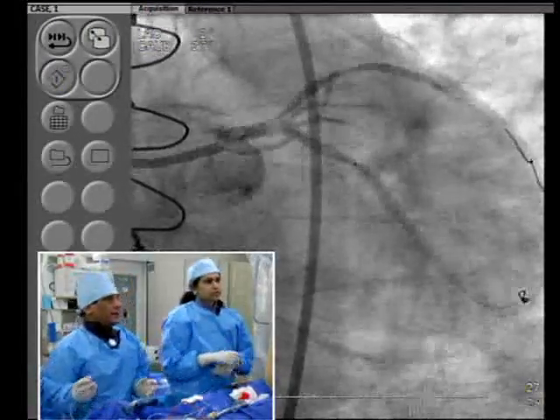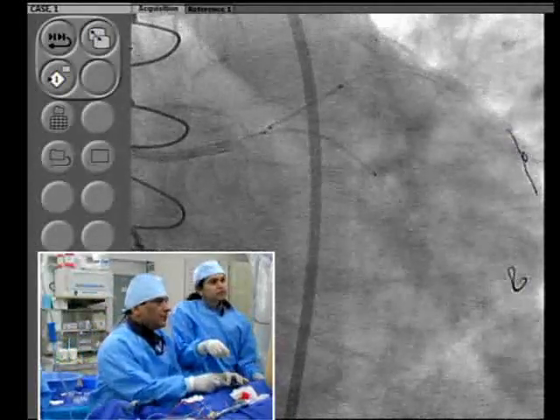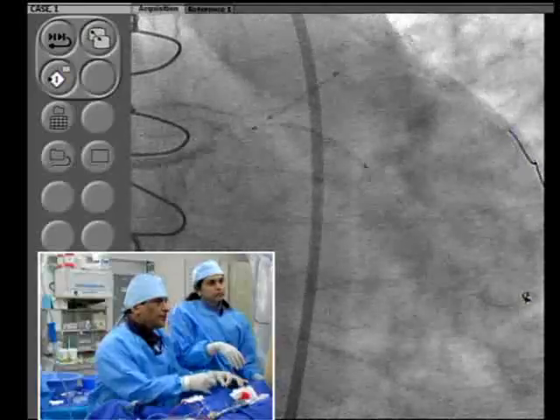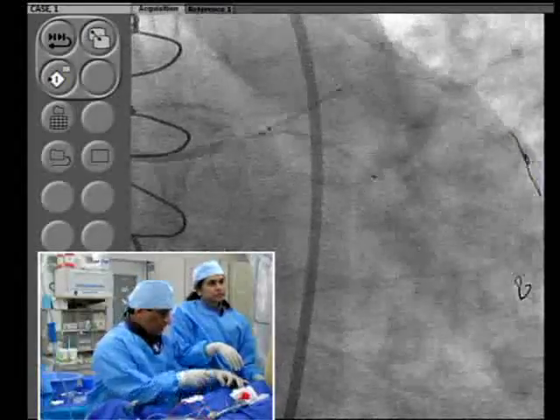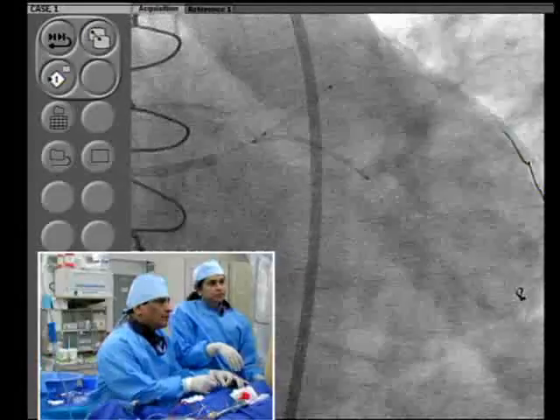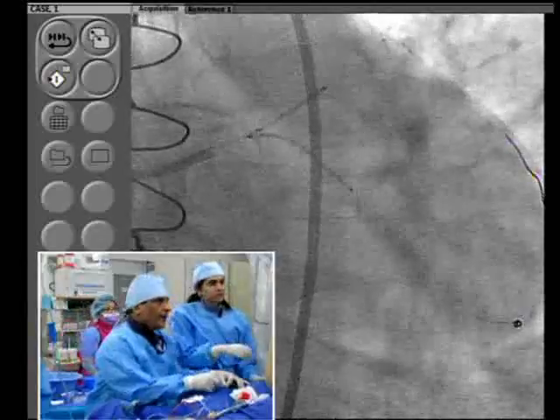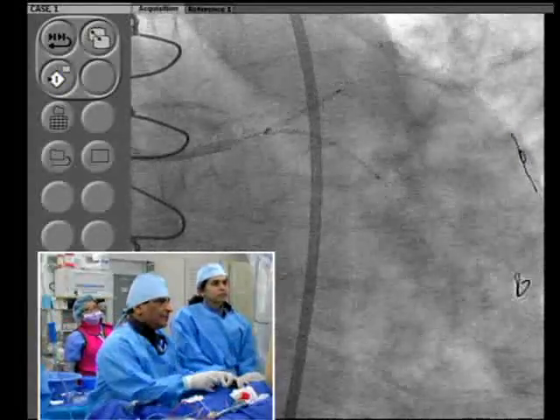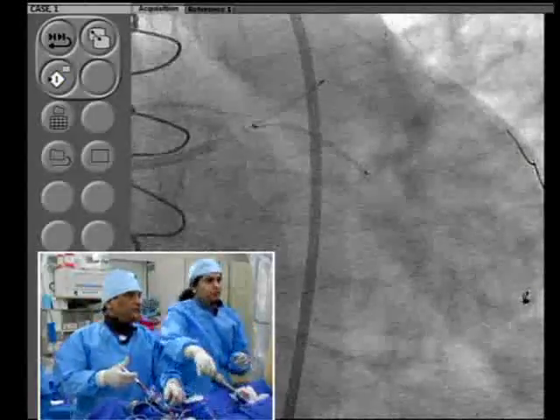Now you can see here, we can go a few millimeters in with both of them. Right, because that would cover that little area which appeared to be of concern in the circumference. Yeah. Sameen, tell us now the three-part strategy which you routinely use to dilate for SKS. Yeah, and this actually will be the ideal case, and then of course we'll try to show from the IVUS point of view how it looks.